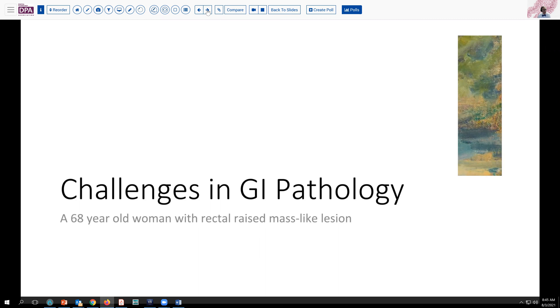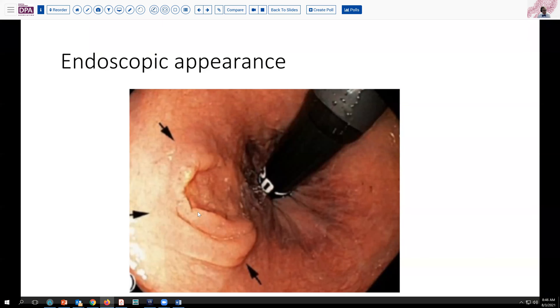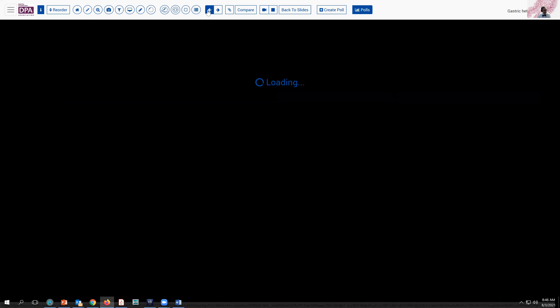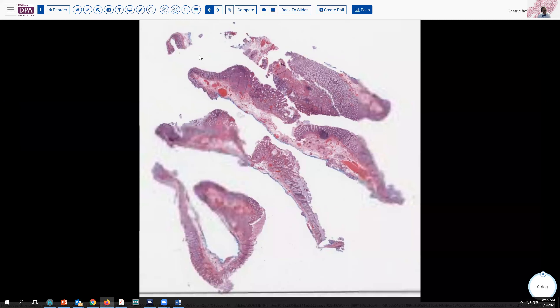The endoscopist takes a photograph using retroflexion of the endoscope, and you can see that it has a slightly rolled border, maybe a little bit of central depression and variable nodularity to it. It looks different than the surrounding rectal mucosa. So after a biopsy is obtained, they come back and provide us with an endoscopic mucosal resection from which my slides here are taken.